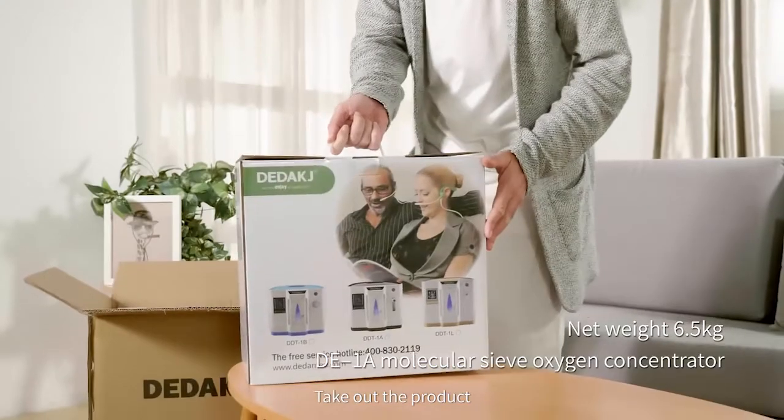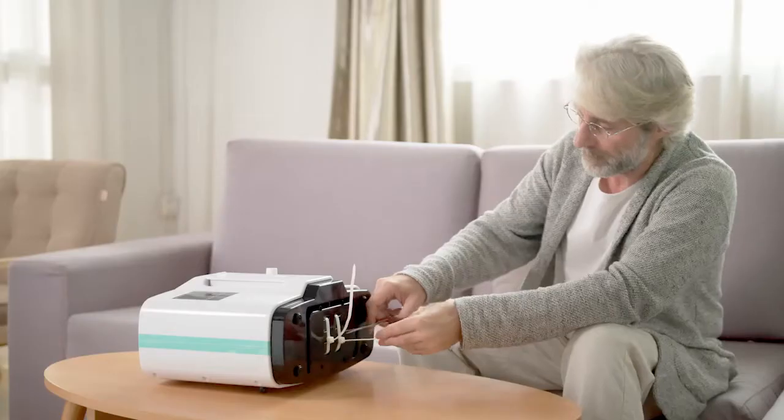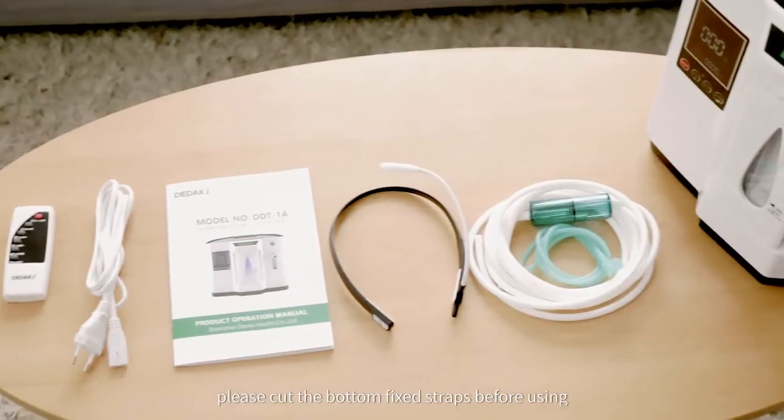Take out the product and open the product packaging. Please cut the bottom fixed straps before using.